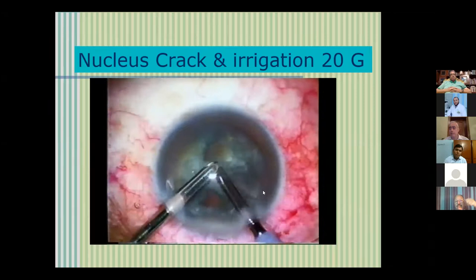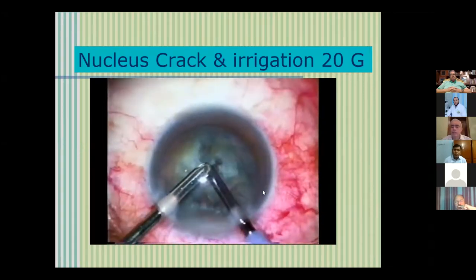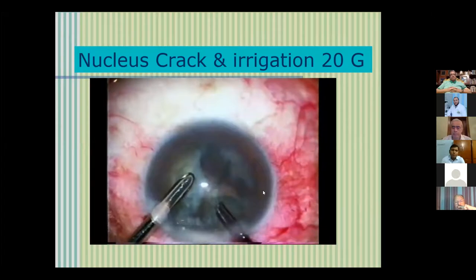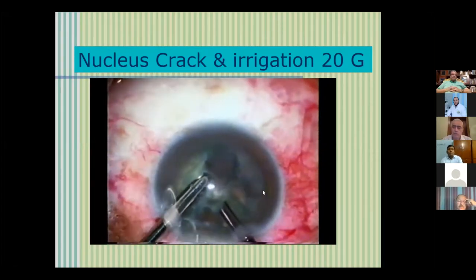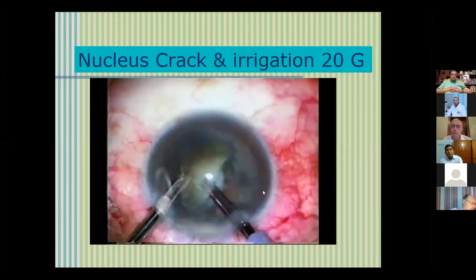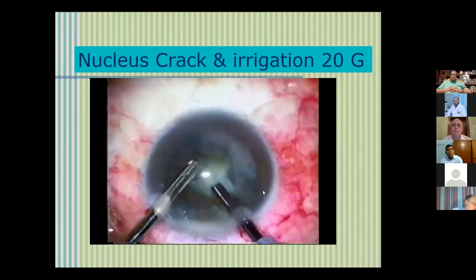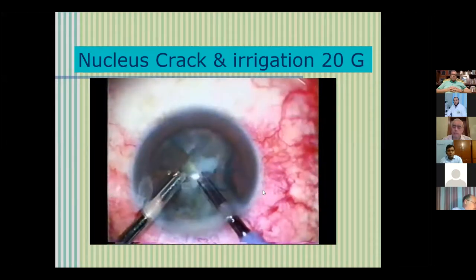There is no sleeve, and there is no irrigation, and it's moving more easily and more smoothly than inside the anterior chamber. And you don't need chopping during the surgery. You just move, manipulate, and move. And you can use the irrigating handpiece just to help yourself by feeding the beast, feeding the bare phaco tip with the irrigating handpiece.